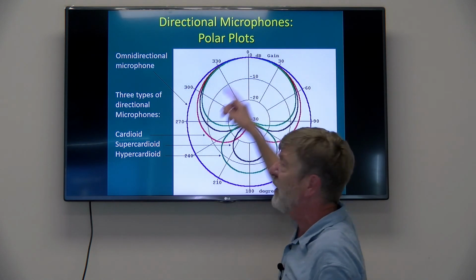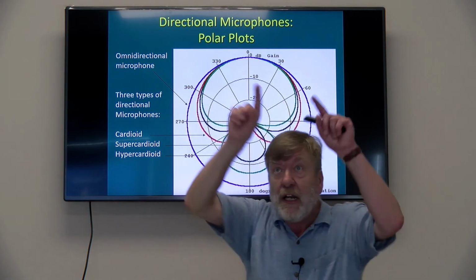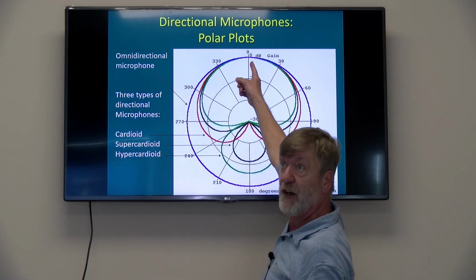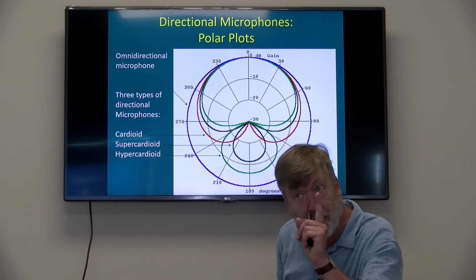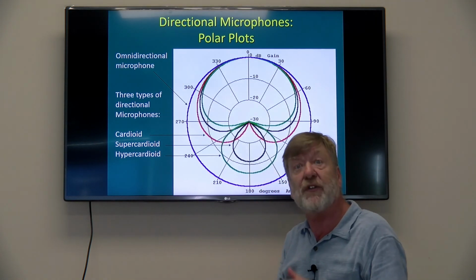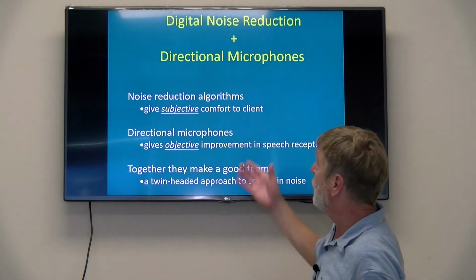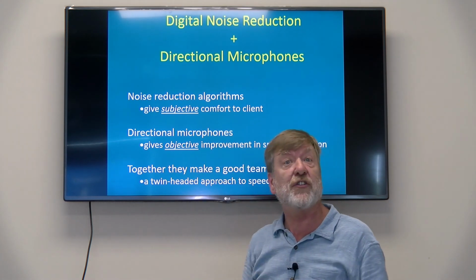This is kind of a picture of the sensitivity pattern of a directional mic. Normal microphones would be the blue circle. They're equally sensitive to sounds coming from all directions. Directional mics might be called cardioid, like this red heart, sensitive to sounds from the front, but not from the rear. Or they might have other directional patterns, but the point is, all directional microphones are less sensitive. The green, the black, the red are three different directional microphones. And notice all of them are less sensitive to sounds from the sides and the rear than the regular omnidirectional microphone is.